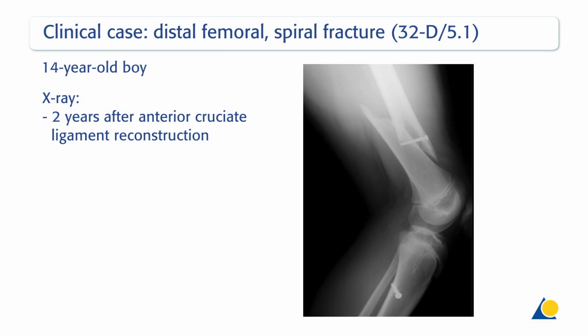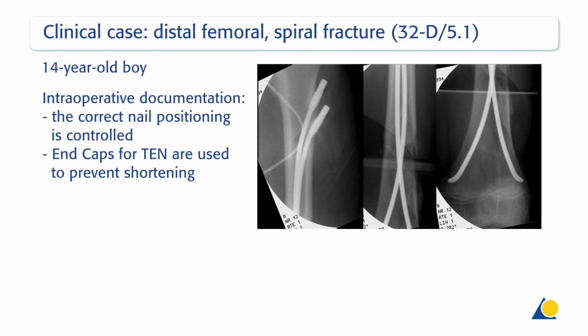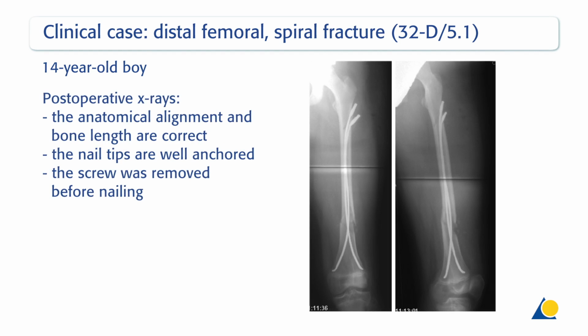The clinical case shows a 14-year-old patient with a distal femoral spiral fracture 32-D/5-1. The X-ray shows the fracture and the fixation used for anterior cruciate ligament reconstruction that was performed 2 years ago. The intraoperative documentation shows the correct nail positioning. The end caps are used to prevent shortening. Post-operative X-rays demonstrate the correct anatomical alignment and bone length with the nail tips well anchored. The screw for the anterior cruciate reconstruction was removed through a small skin incision before nailing.